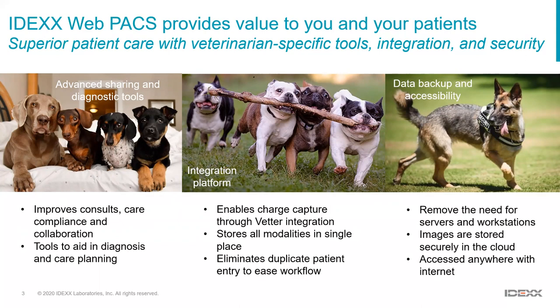manage those databases. And typically speaking, in animal health and specifically the general practice, small animal health, we've been using PACS software ever since diagnostic imaging came into our marketplace. If you guys are like most of the practices that have adopted any kind of digital imaging in the past, typically speaking, your DR, your CR system, your ultrasound, your digital dental, if you have advanced imaging like CT or MR, those have all come with some kind of a PACS, maybe a full featured PACS or maybe a basic PACS, but some kind of a software that allows you to manage those images and recall images, share images, or share them across your network.